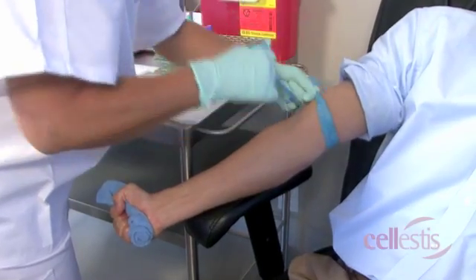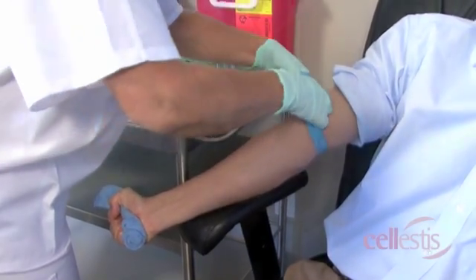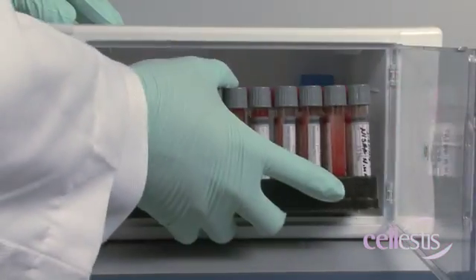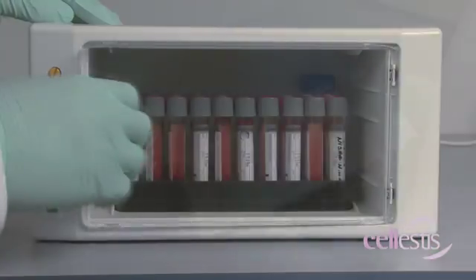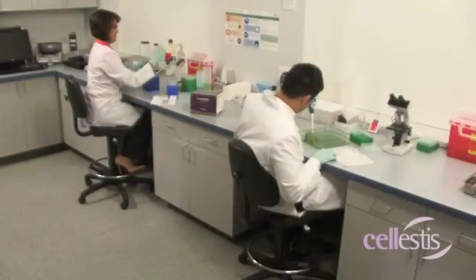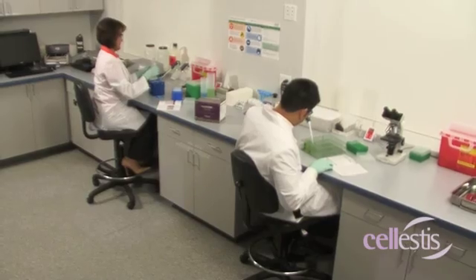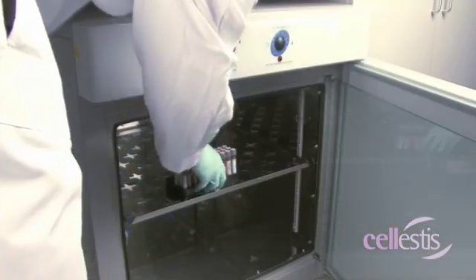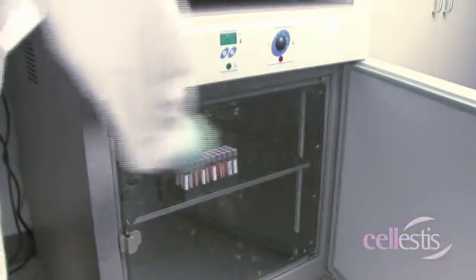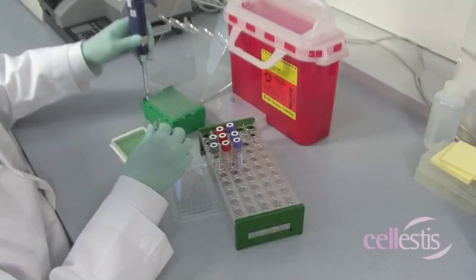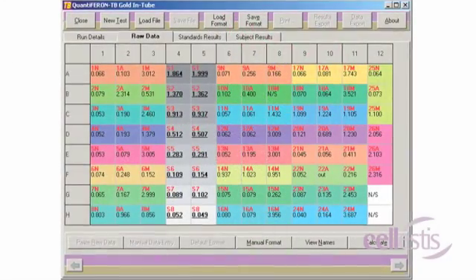Generally, the clinic only performs the blood collection step. In some cases, they may also perform the incubation step. Samples prior to or after incubation are then shipped to the laboratory. If the laboratory receives unincubated samples, the laboratory performs the incubation step first, followed by the QFT ELISA and data analysis steps.